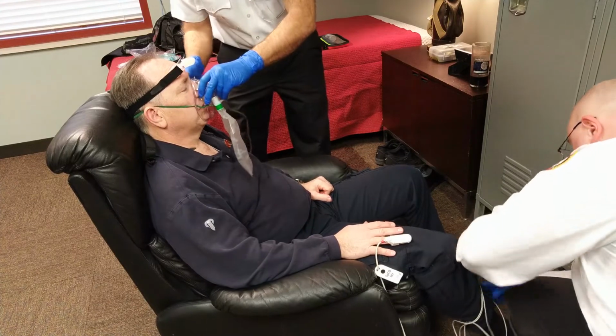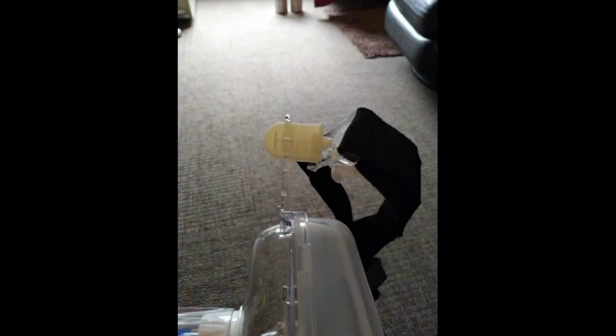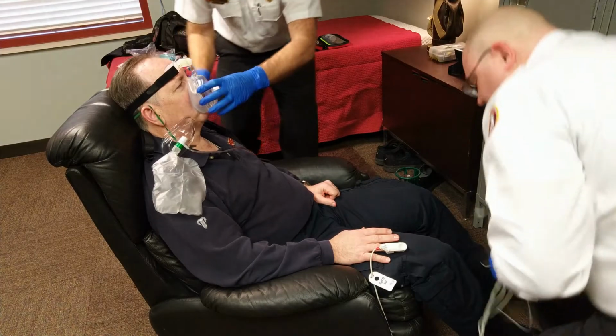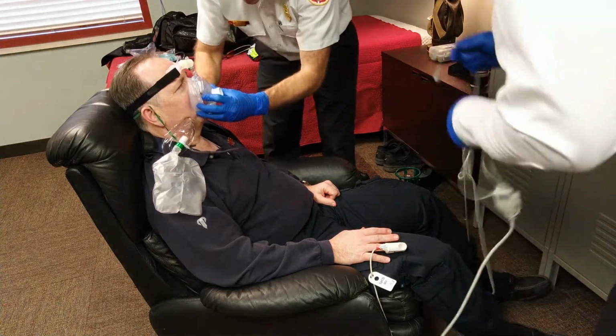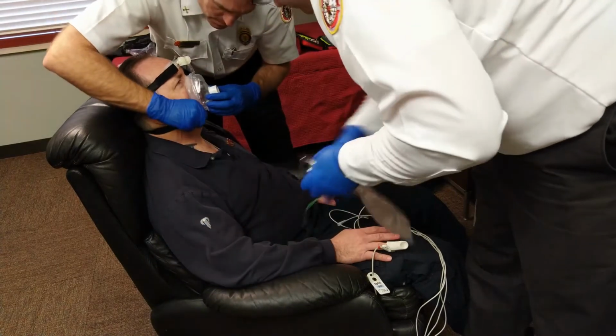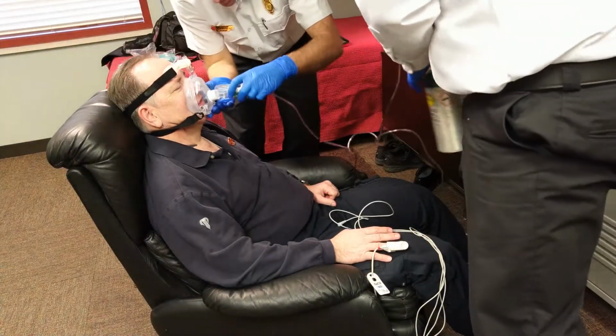Cameron is applying the head strap and head fitting device first, and what we found, and this was actually a really clever idea on his part, we found that it worked a lot better if you apply the straps before you put anything else on. It makes it a lot easier to get it adjusted. So once the straps are sized with the Velcro and appropriately fitted to the patient, then we'll apply the mask.